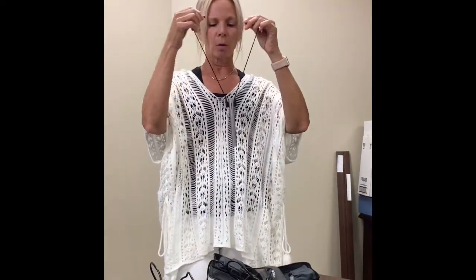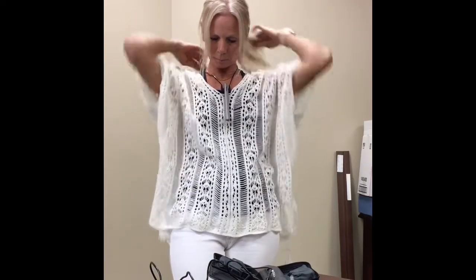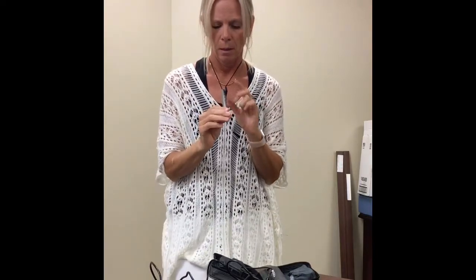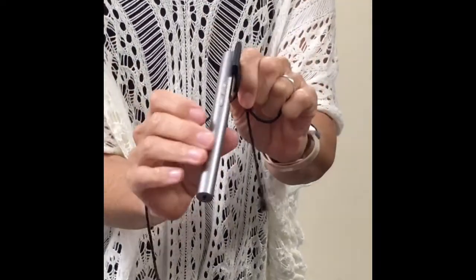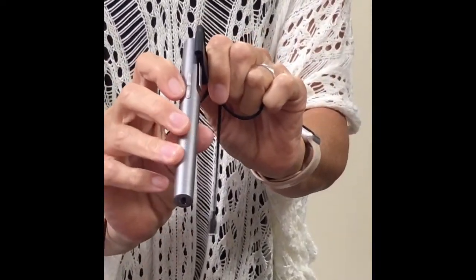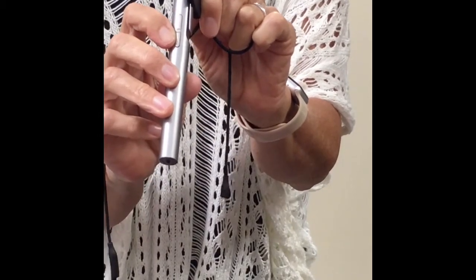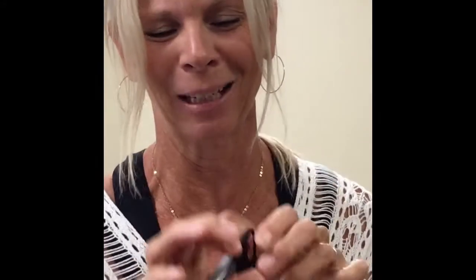Now the microphone will already be connected to your student's device, so we will set that up, but for that to happen, on the side of the microphone, I'll take this off and bring it in a little closer, there's a button right here that looks like a chain link. It looks like a piece of chain link. It's the connect. In sign language, this means to connect.